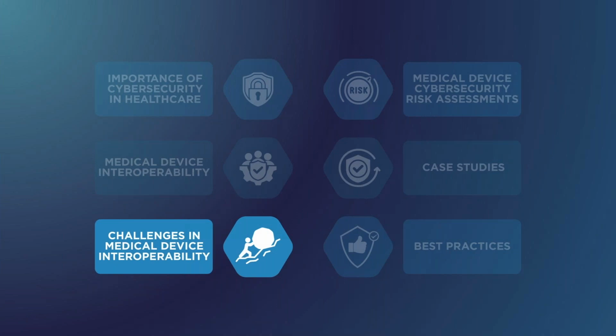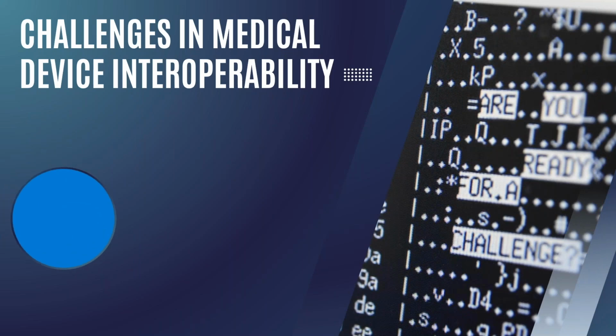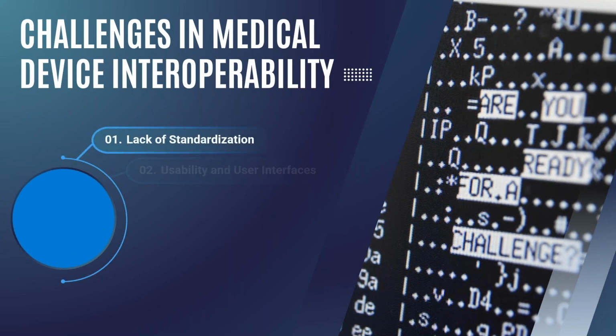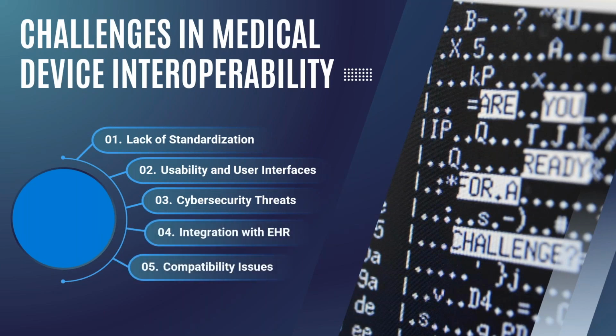All right, and now challenges in medical device interoperability. So the challenge we're facing is lack of standardization. There is not a set standard of how to integrate a device, or if you buy multiple pieces of equipment, you can't bulk buy the same manufacturer model. So there's a lack of standardization in how to set that device up on your network. What ports and what protocols do you actually need? Where does it look to?